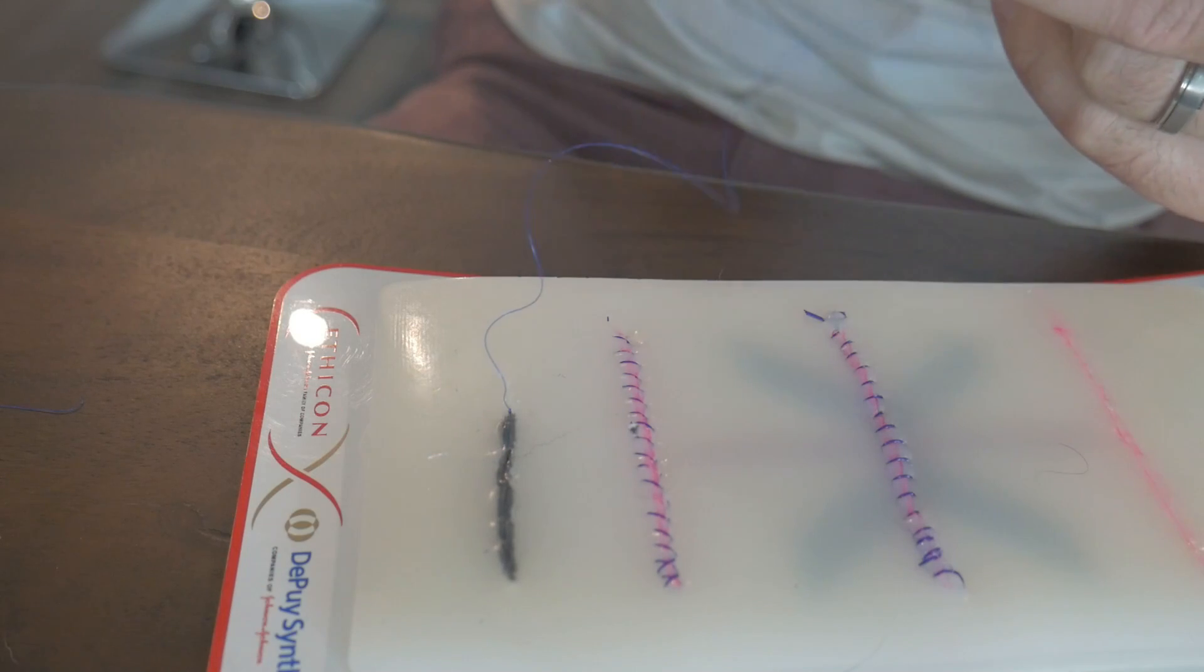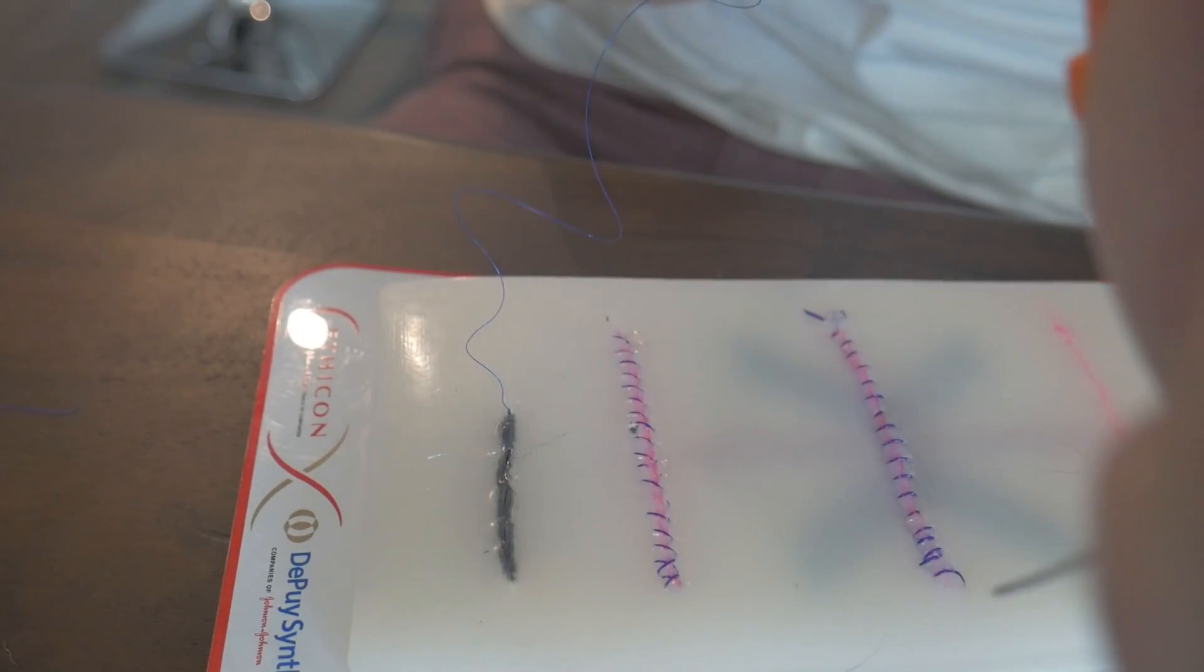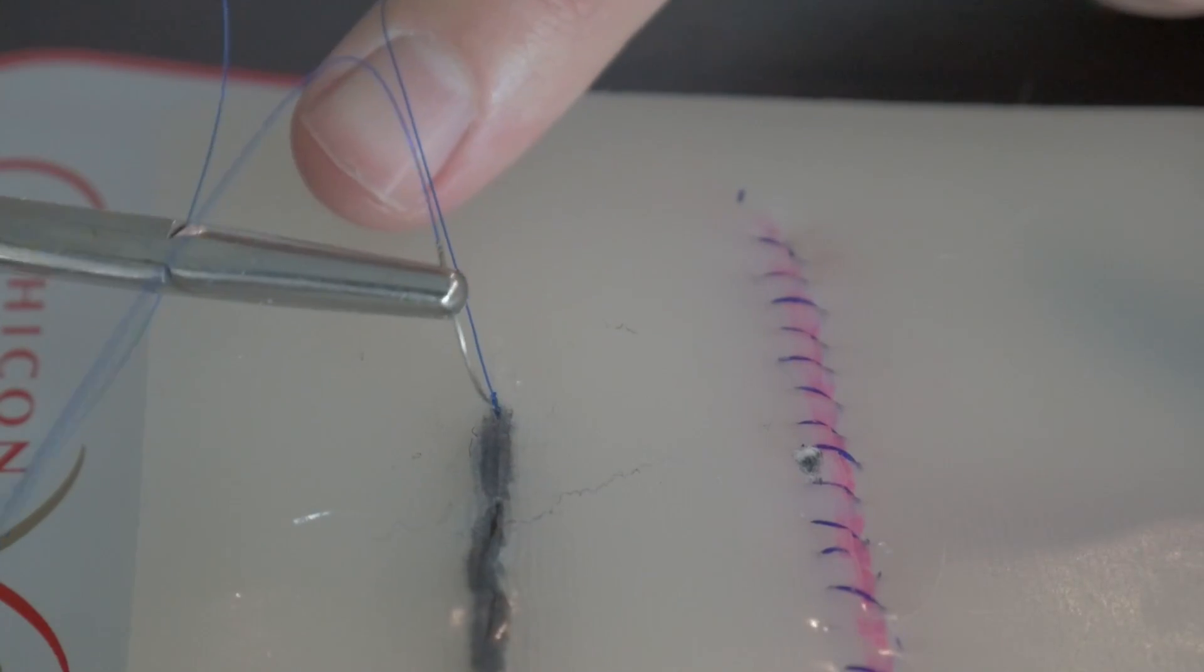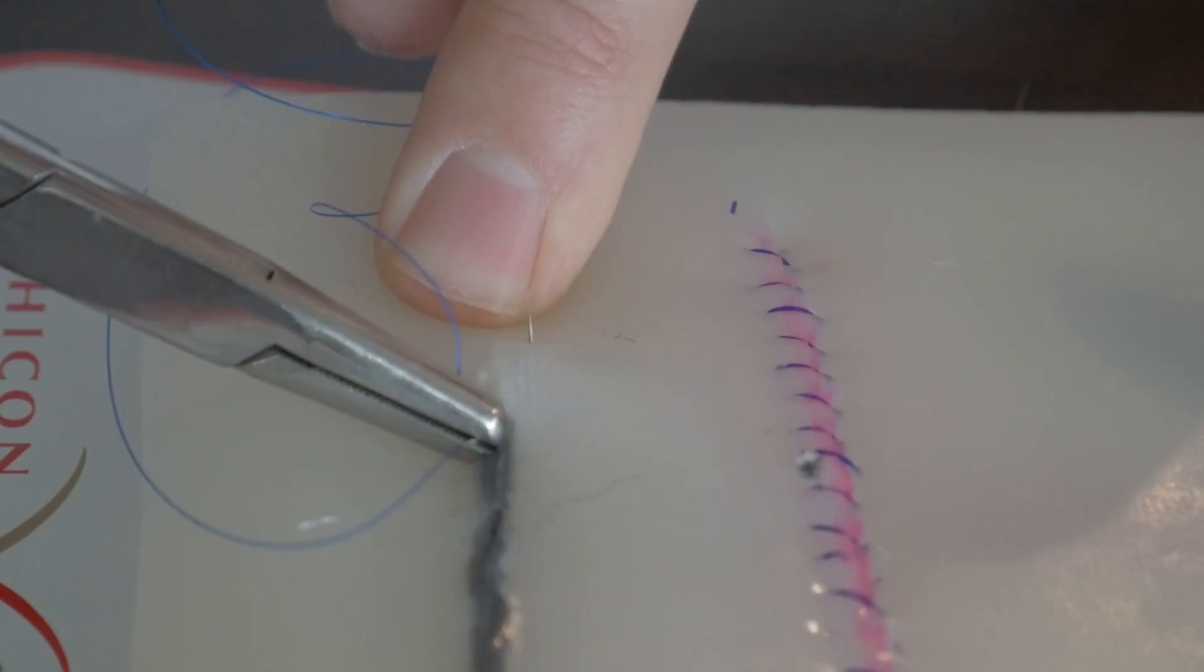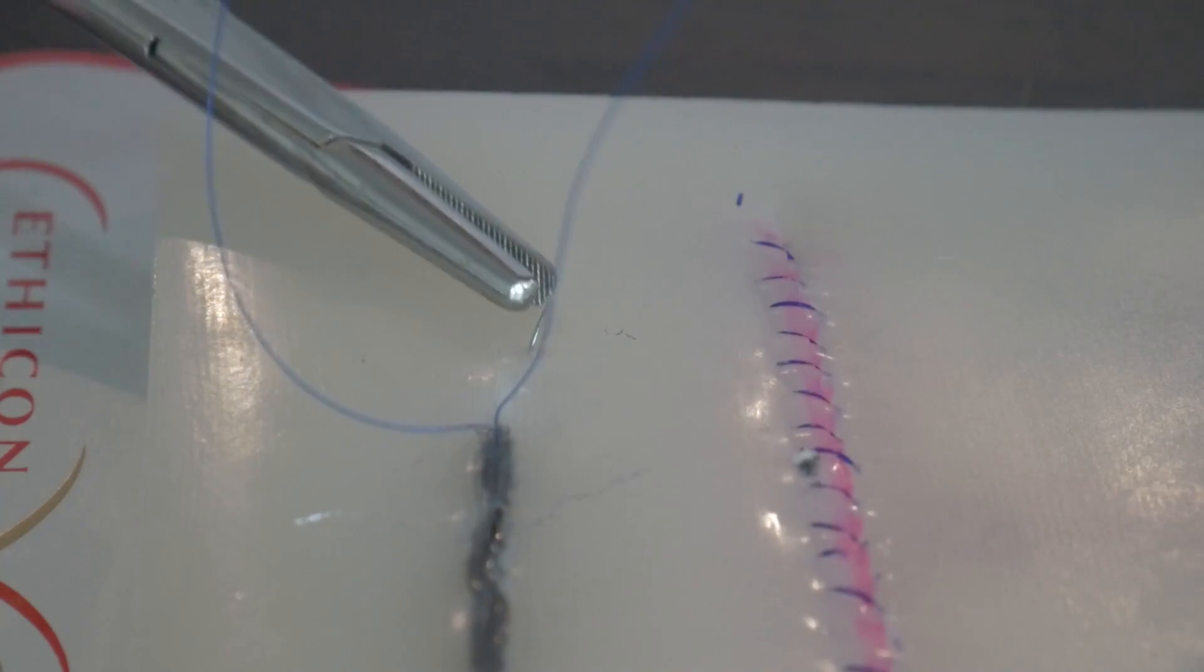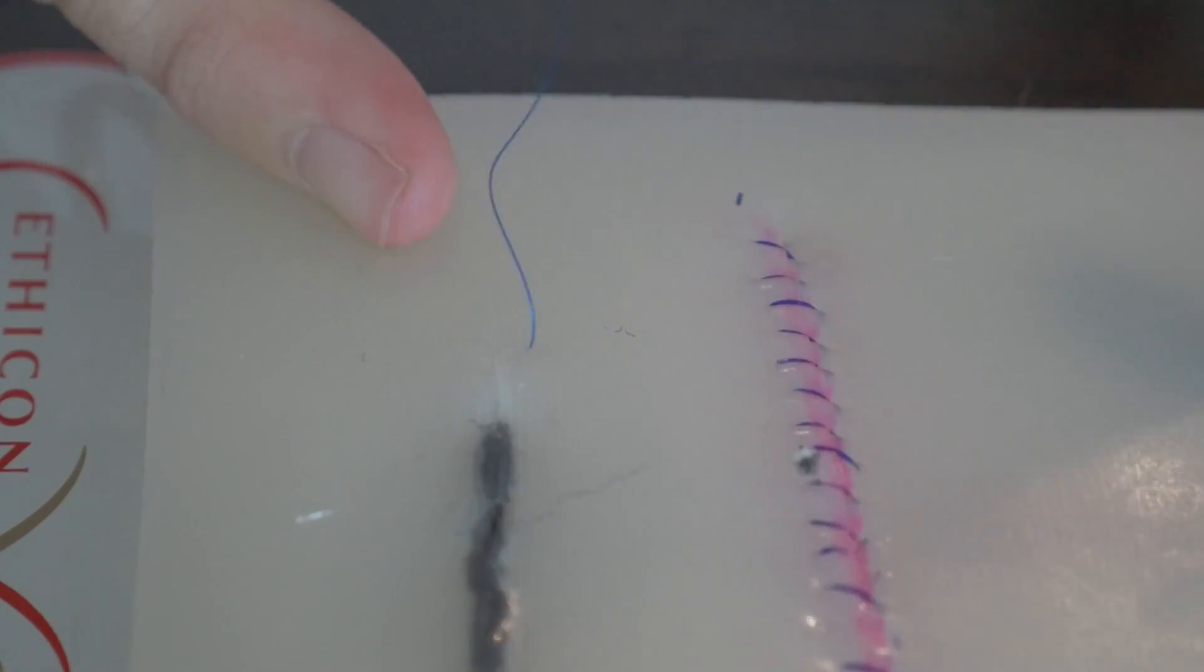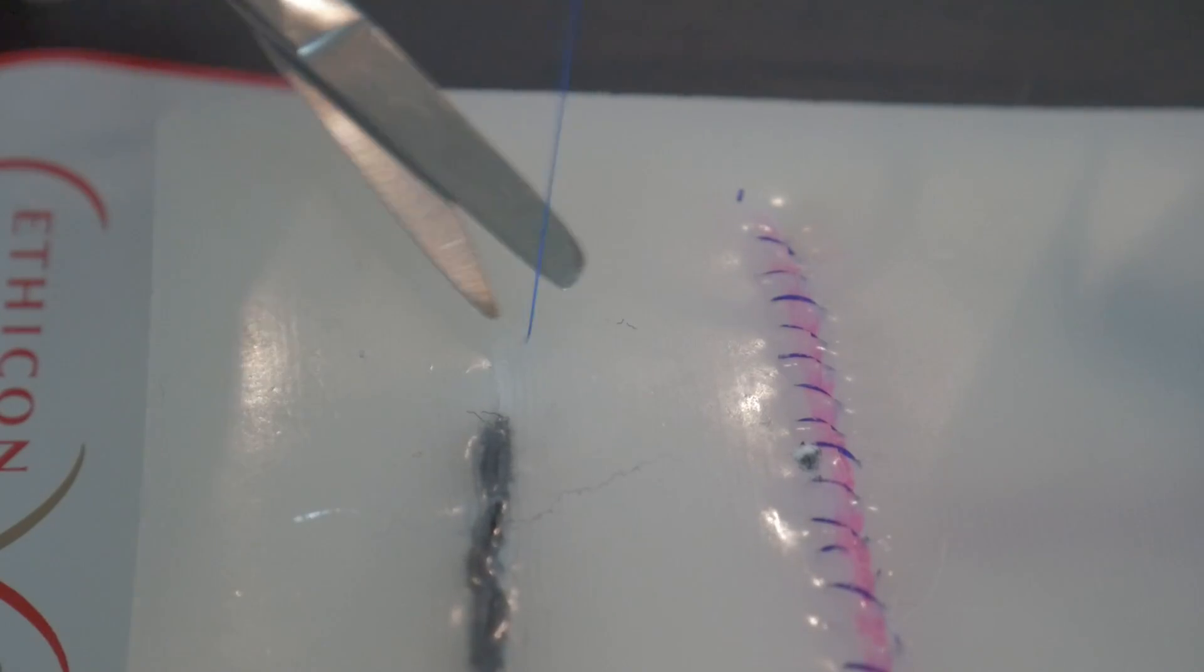And I will lock it by pulling the stitch through the loop and that locks it in place. Now you can see that the knot is really superficial, but what I'm going to do here is I'm going to take hold of the suture and very similar to the other side, I'm going to go right underneath the knot, hold the suture up, go right underneath the knot, come out. And that pulls the suture right on down. Bloop. It's gone. You don't see that knot anymore. It's beautiful. Everybody loves it. And cut it off. That is a running subcuticular stitch.